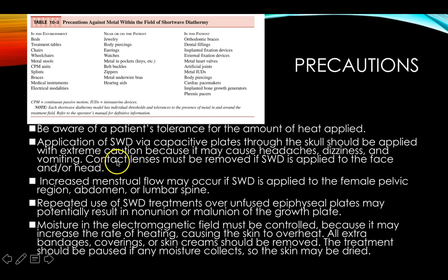And I love this. I'd never heard this one before about contact lenses, that they should be removed before we apply shortwave diathermy to the face or the head. It's because those can dry out and heat up, and you don't want that on your corneas. So you should remove contact lenses. But most of what we would do would not be treating the head or the face anyways, so it's not usually a concern for us.